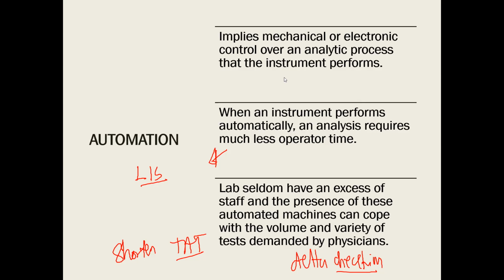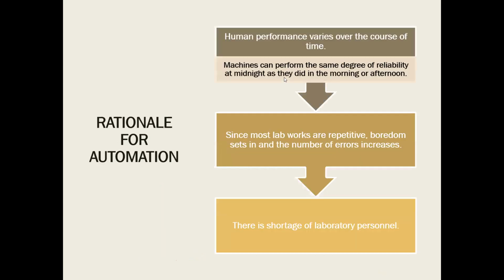threatened if laboratories nowadays are working under automation, because those machines will not function well without the care and the love of a medical technologist who is performing the controlling and the standardization of the machine. Okay? Now, what are the rationale for automation?